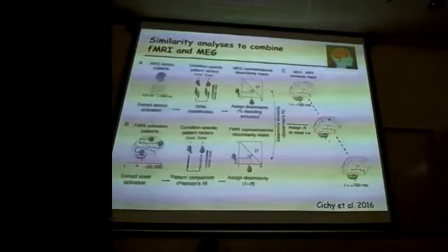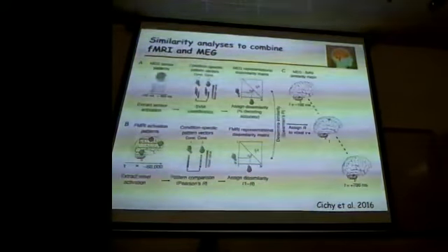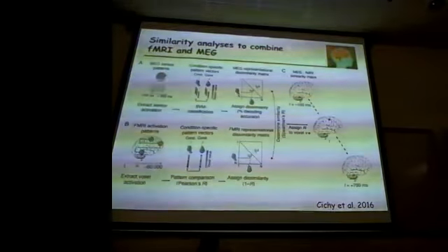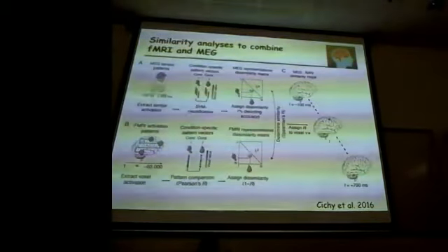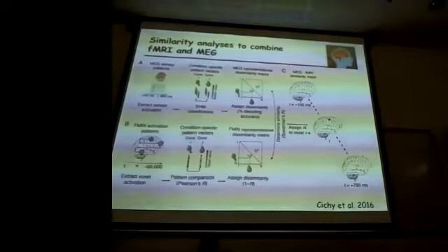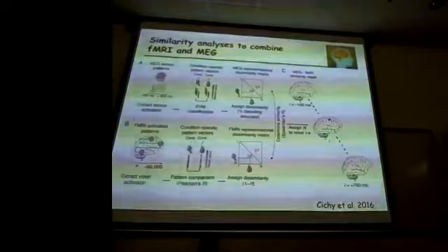Really, the standard approach for MEG analysis at this point, to differentiate it from EEG, which primarily has focused on sensor level analysis, is you get your MEG data, you do source localization, and you do something with it, right?